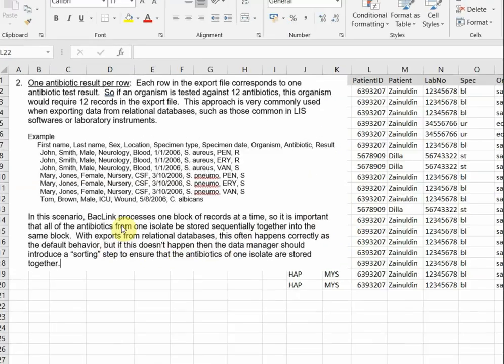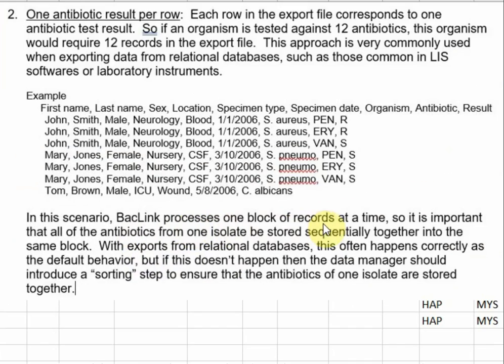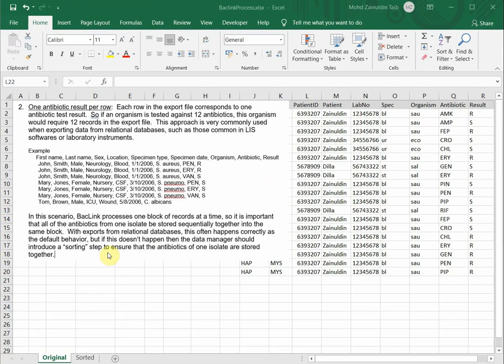I will explain to you the manual by giving you a sample here. In the manual it says BacLink processes one block of records at a time. So it is important that all the antibiotics from one isolate be stored sequentially together into the same block. If they are not in the same block, the number of isolates after the BacLink process sometimes could be almost double the number of isolates we should have in our lab.